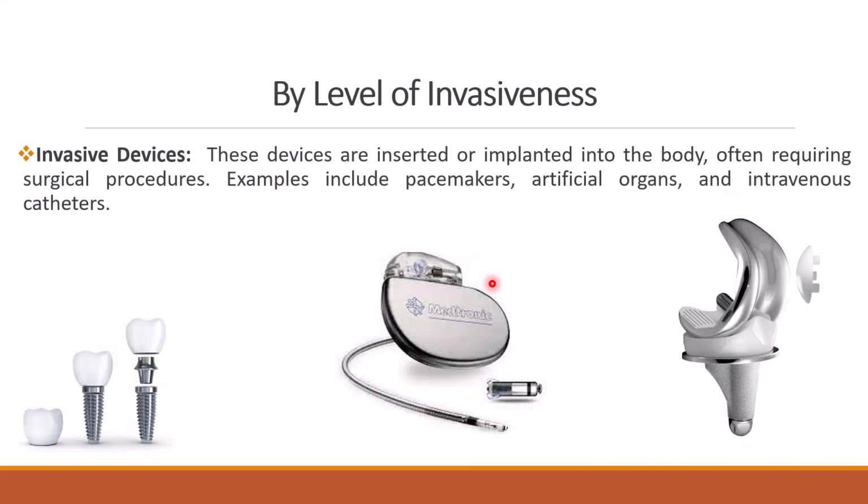But on the other hand, we have the invasive devices, where we need to do a big surgery for the patient. We need to cut the patient's tissues and put in the medical device. These devices are implanted into the body, often requiring a surgical procedure. For example, we have the pacemaker, artificial organs, and the dental implant also.